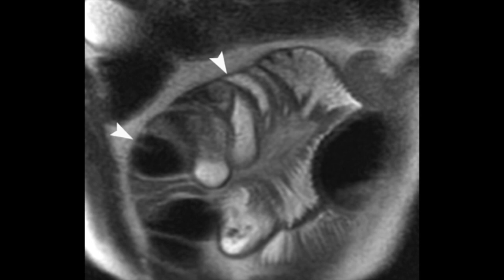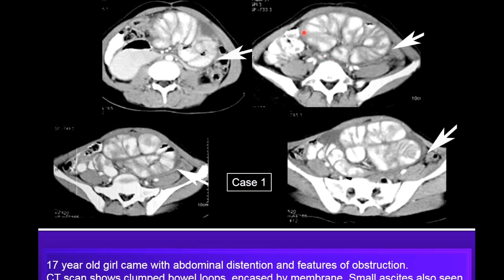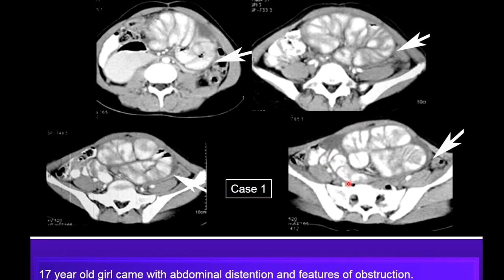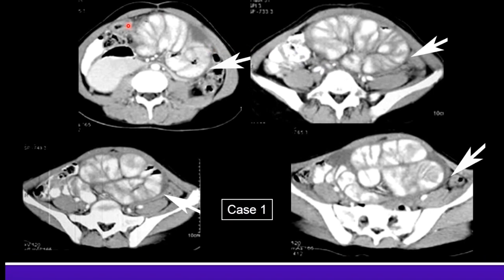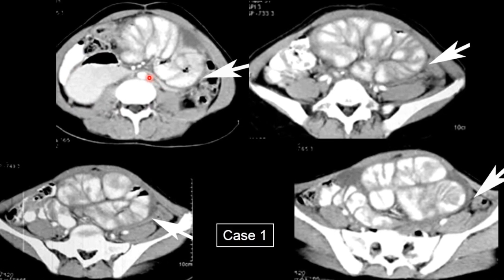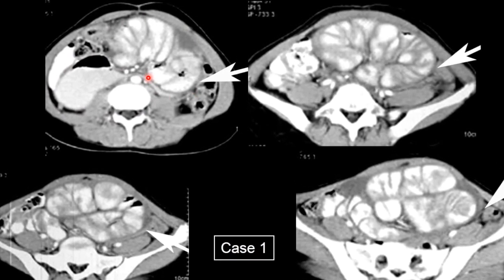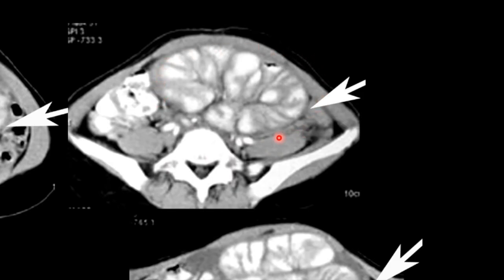MRI also shows similar findings. The first case is a 17 year old girl who came with abdominal distension and features of obstruction. Positive oral contrast was given and multiple small bowel loops encased in a membrane-like structure are seen. Proximal bowel loops are dilated but the loops inside the cocoon do not get the opportunity to dilate because they are bound by the encasing membrane.